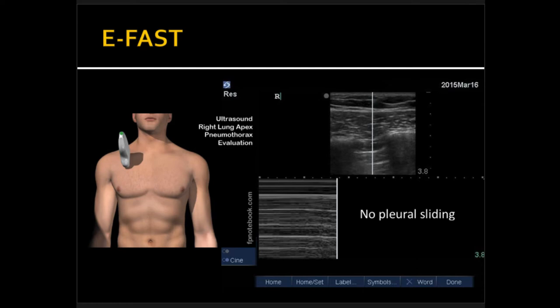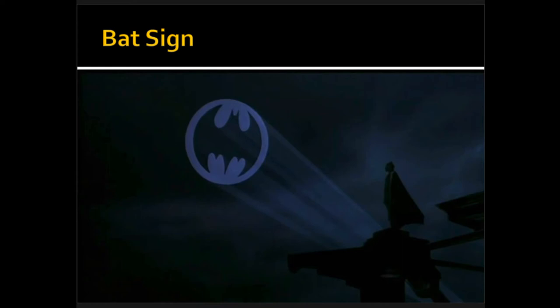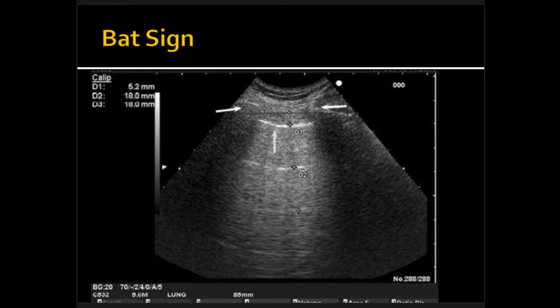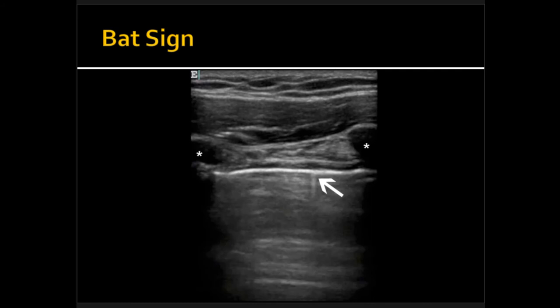For those of you who are new to this or want a refresher, there is a line-by-line approach so you don't miss anything. The first thing I like to think about is the BAT sign — like Batman. This is a bat on ultrasound. It's essentially the two rib shadows on top, separated by a horizontal pleural line in the center, with A lines reflected below it. Two ribs flanking the pleural line in the center — that's your BAT sign.